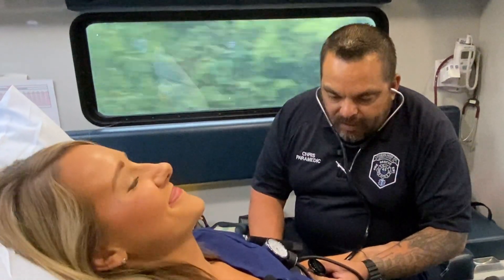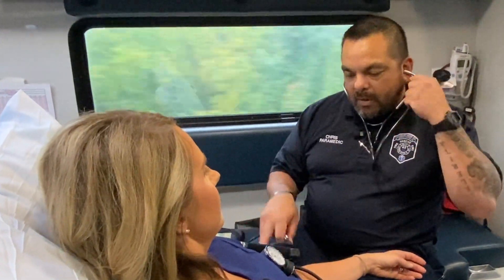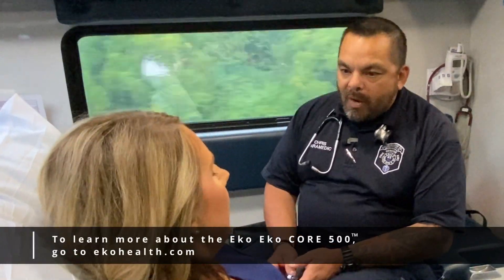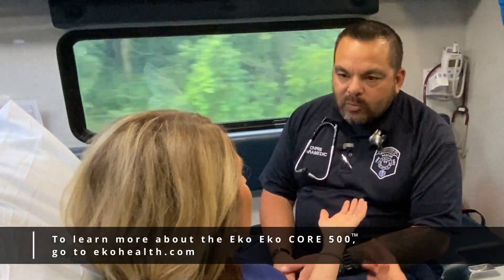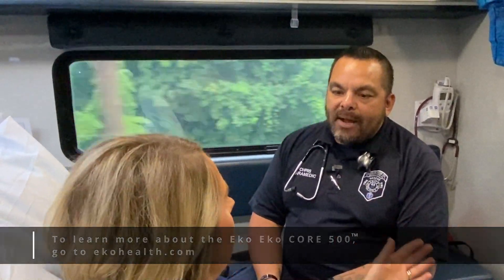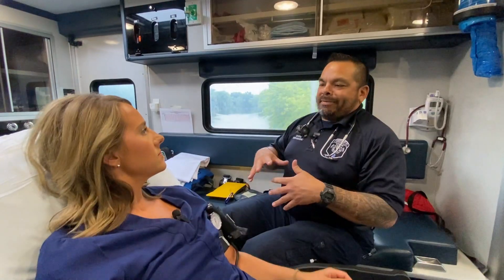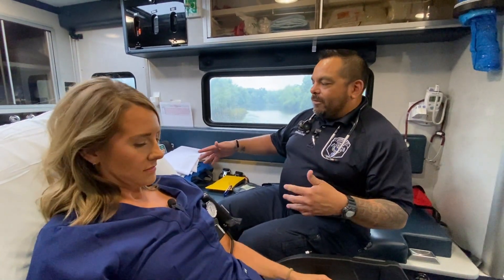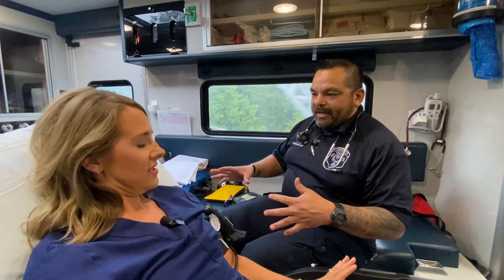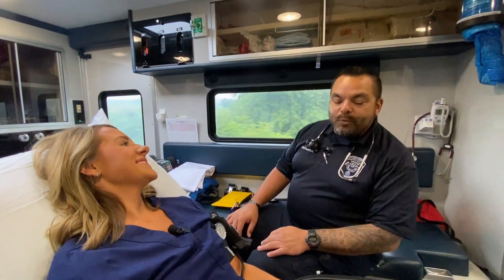It gives a very distinct heart sound that I can differentiate between background noise and bumps in the road. You can imagine with an analog stethoscope how difficult it is — you usually have to wait until you're at a stoplight or something if you're not running lights and sirens. And we all know how hard it is to learn that skill as a beginner. So to be able to do that in a moving vehicle with background noise — all of that. Of course, we're going to get what looks like an abnormal EKG just because we're in the back of a moving ambulance and every bump in the road creates artifact. If you hit four or five bumps in the road, you're like, 'STEMI,' and then you have to give it a second and figure out what's really going on.